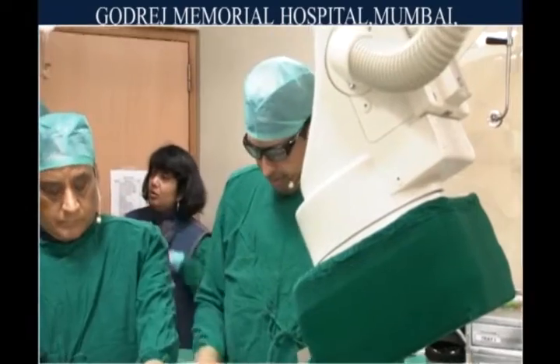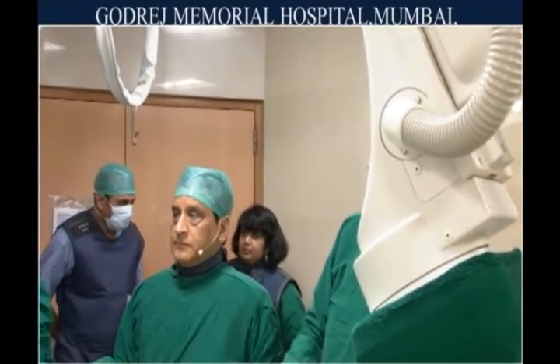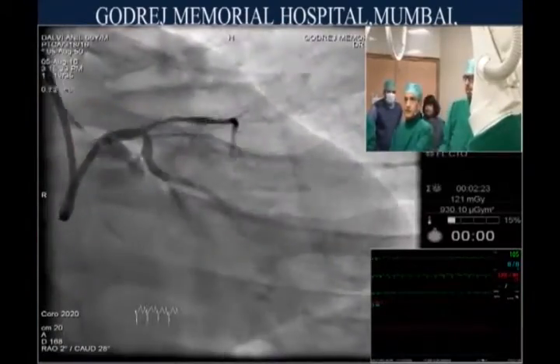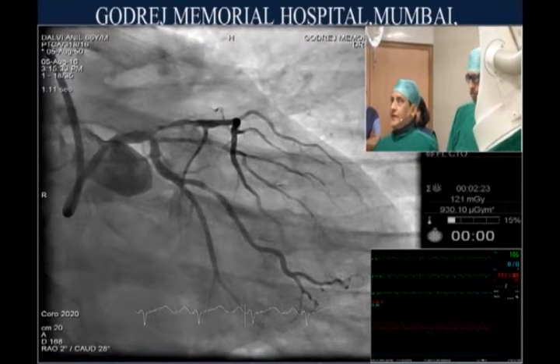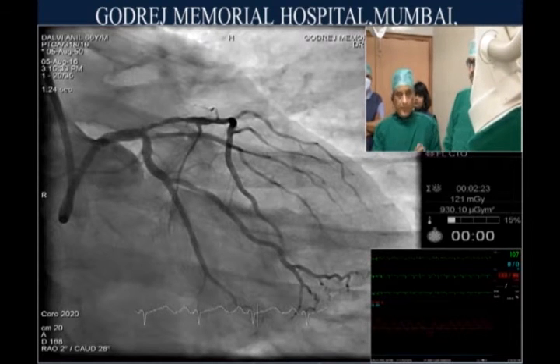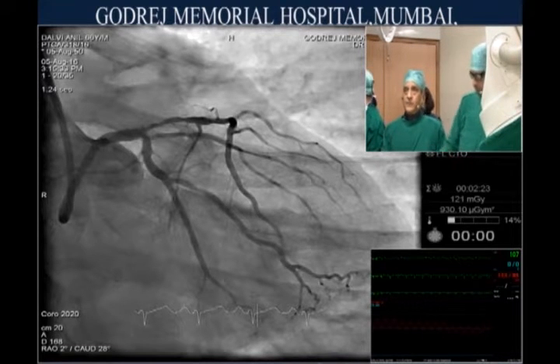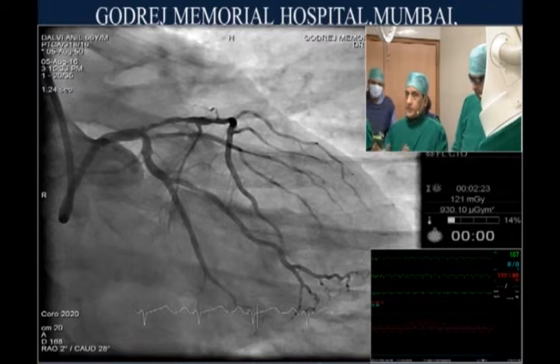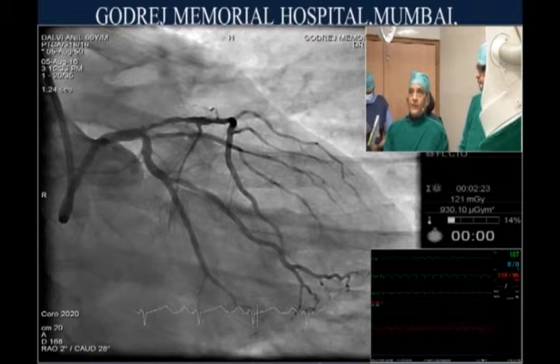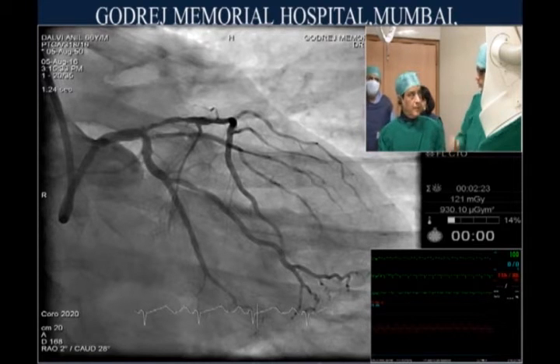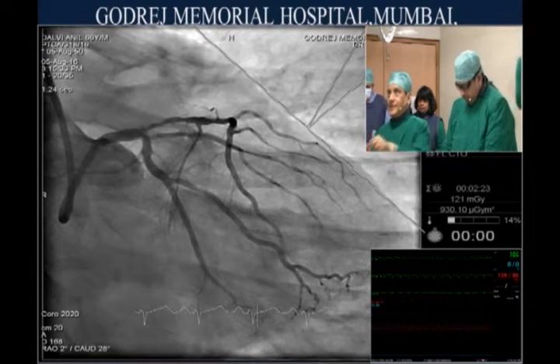The angiogram shows distal left main disease. We are not giving much dye because the patient is coughing, which usually means high EDP. We gave IV Lasix and a beta blocker 2.5mg, and the patient is settling down. We are ready to proceed — this is a zero-one-one bifurcation and Manish gave a great lecture about the left main, so we are going to do this clinically.